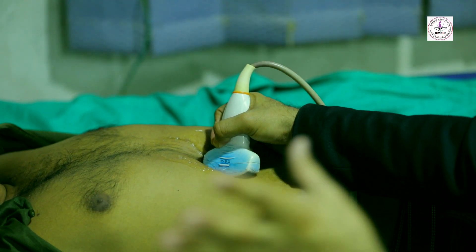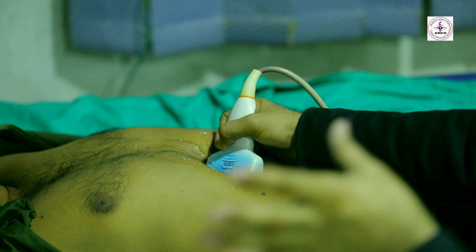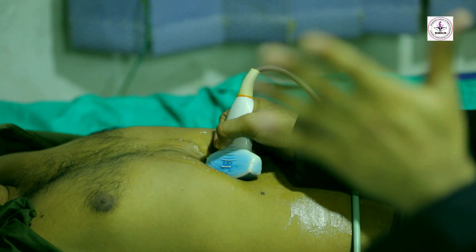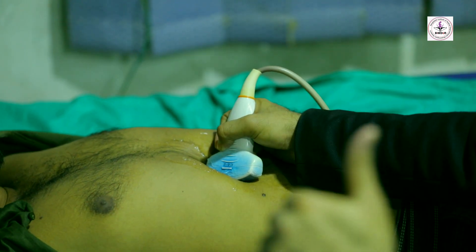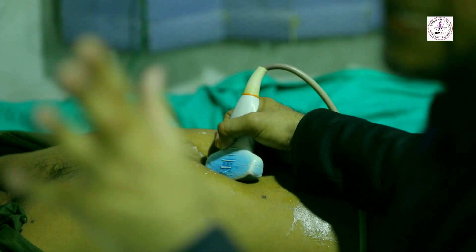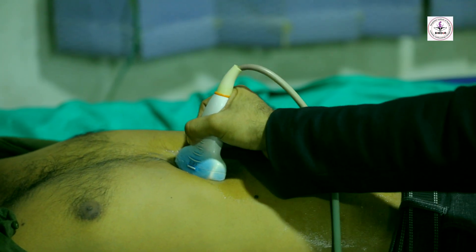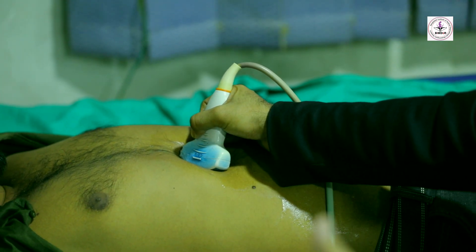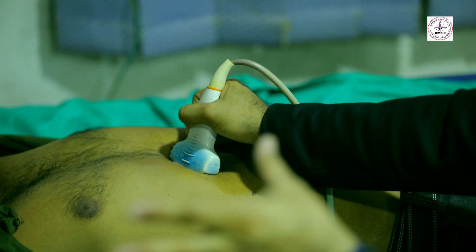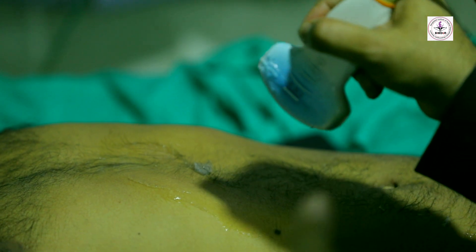Pathology criteria — some criteria for gallbladder pathology like gallbladder stone: the main criteria is posterior acoustic shadow. Stone appears as an echogenic structure — this is the main issue of pathology. When we see an echogenic structure in the gallbladder — like in the fundus, neck, or body — this is the stone criteria. Posterior acoustic shadow also appears on screen. After that, we correlate with other investigations like pathology, biochemistry, and microbiology reports.